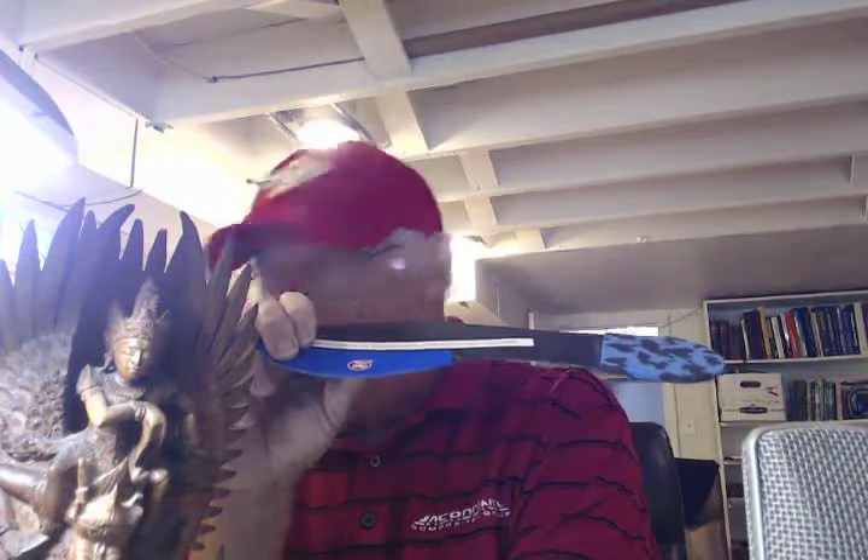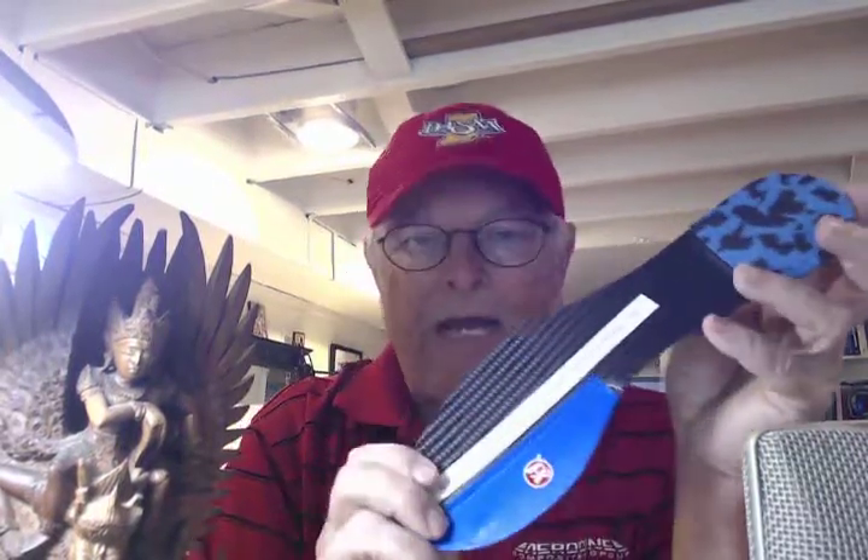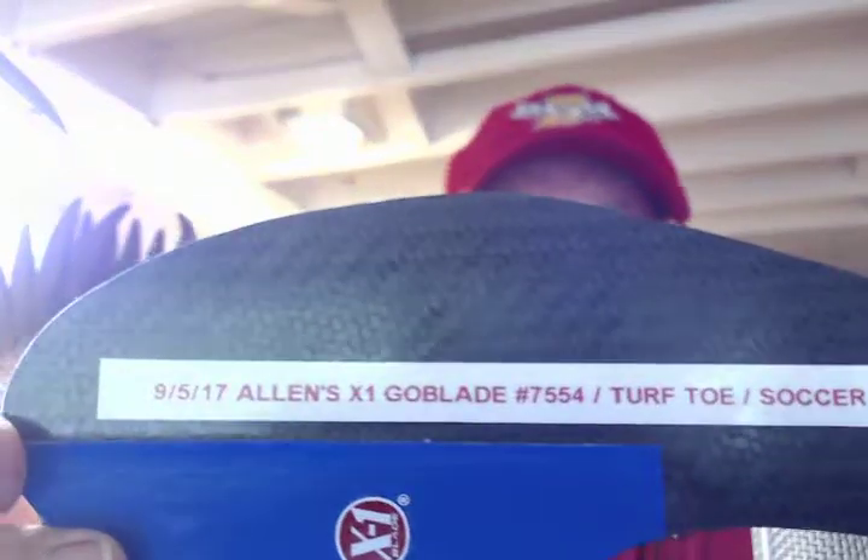It's 3.15 grams in weight and 1.4mm in thickness — real thin, real light. Goes in a soccer shoe. Going out to Allen in Fort Wayne, Indiana, X1 Blade number 7,554.